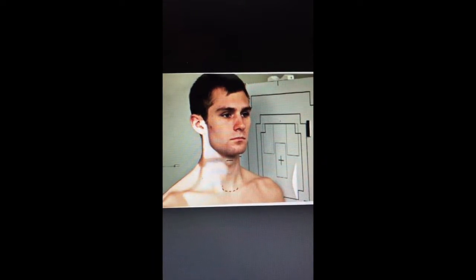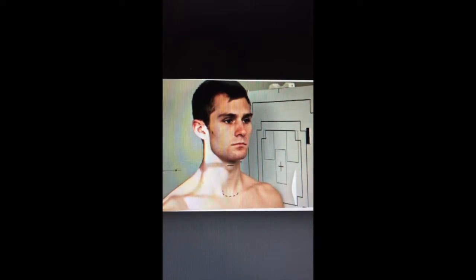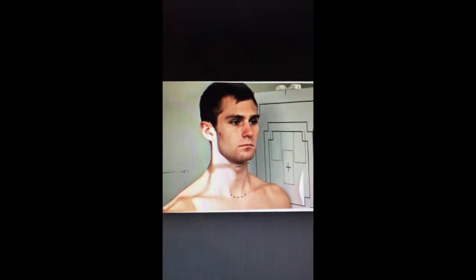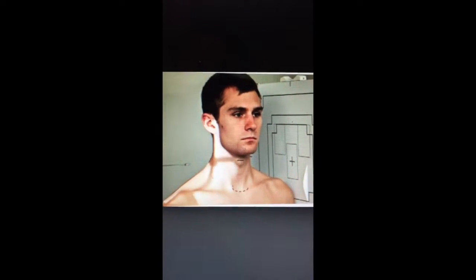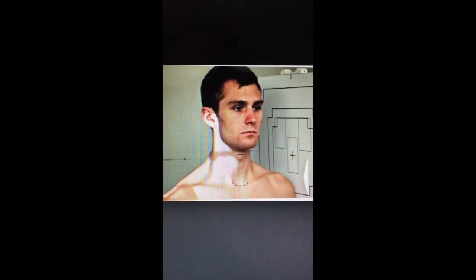The patient needs to extend the chin in order not to superimpose, and has to bring the shoulders down in order not to superimpose. You have to make sure the patient is close to the IR, and this position can be done when the patient is either standing or sitting down.